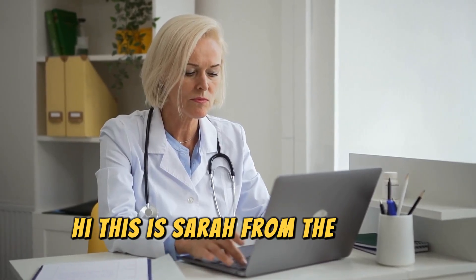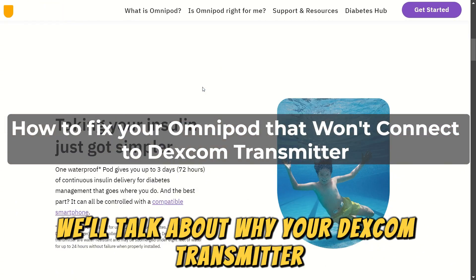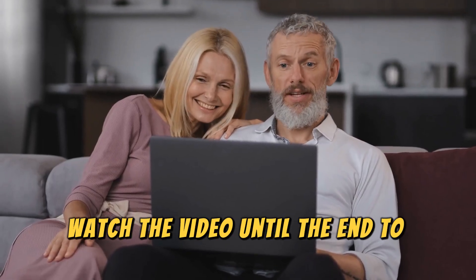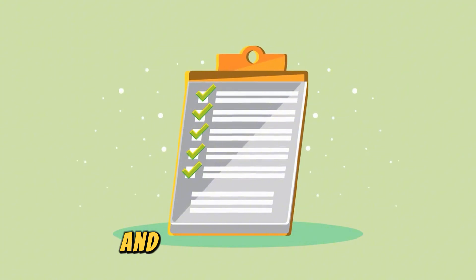Hi, this is Sarah from The Savvy Professor, and in today's video, we'll talk about why your Dexcom transmitter isn't pairing to Omnipod and how to fix the issue. Here are possible reasons why this happens and how to fix it.